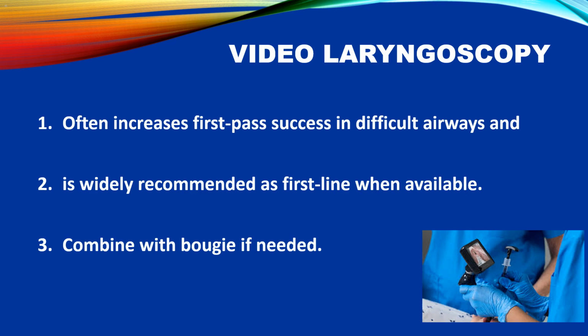Video laryngoscopy. Benefits. 1. Increased first pass success. Often increases first pass success in difficult airways. 2. Recommended as first line. Widely recommended as first line when available due to its effectiveness.